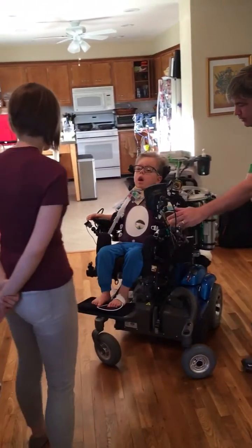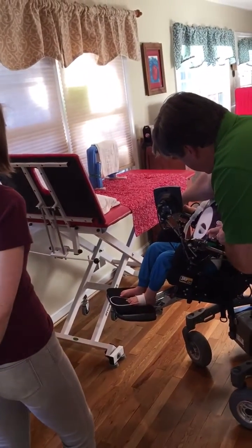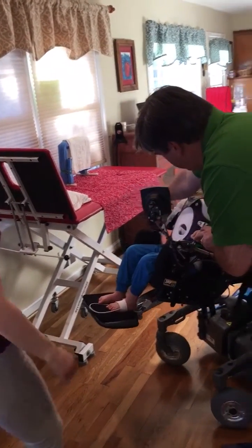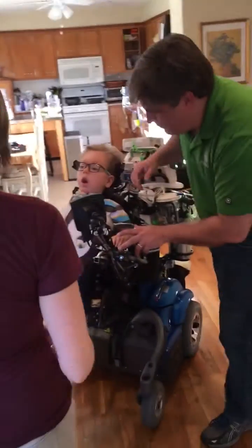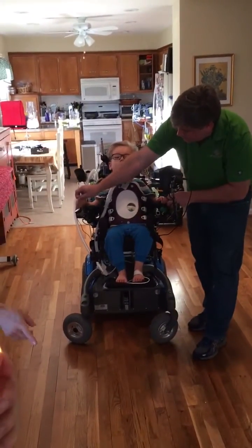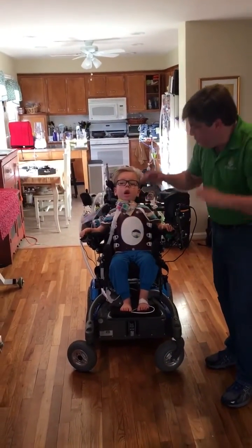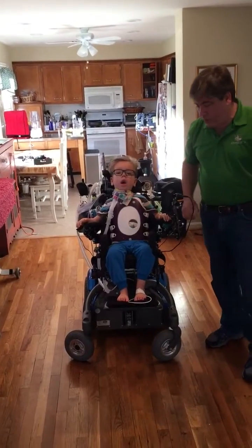All right. Two hands go straight. Let's try this one. Let's line up for your dad again, okay? The balloon. All right. Come get it. All right, let's try this. All right, you have to come over here. Ready? And then I'll give it to you. I'm going to put this on both.